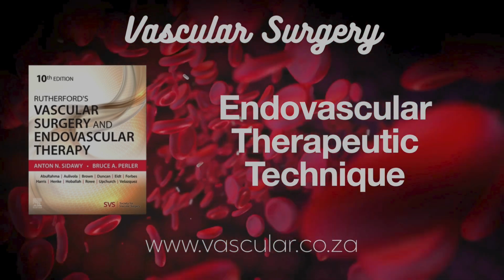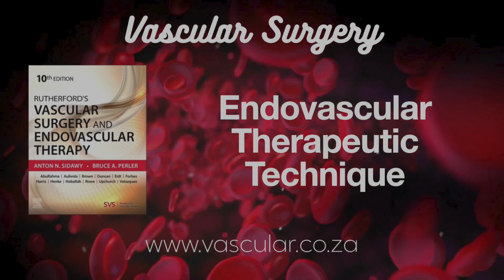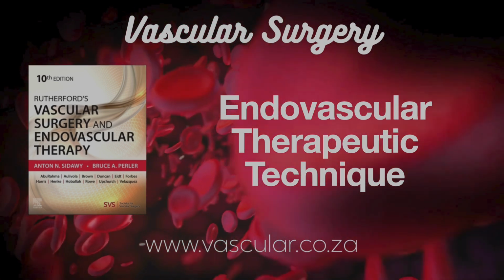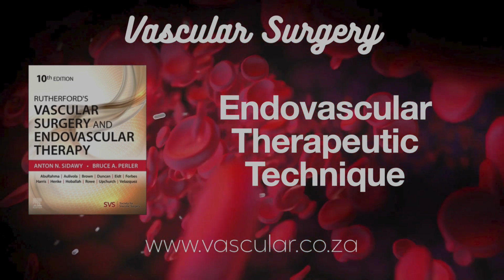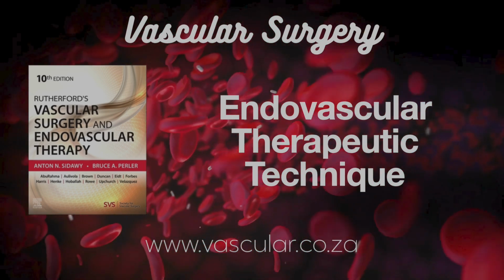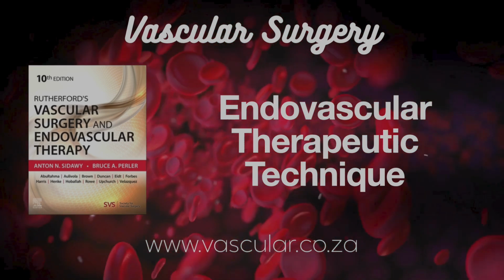Finally, dissection grading after PTA. Why classify the tiers? Dissection is common after ballooning. Grading A to F, based on angiographic look (flap, staining, flow limitation, occlusion), helps decide treatment. Minor ones, A and B, might be okay. Major ones, C to F, usually need stenting to tack the flap down and restore flow. Crucial for deciding next steps.